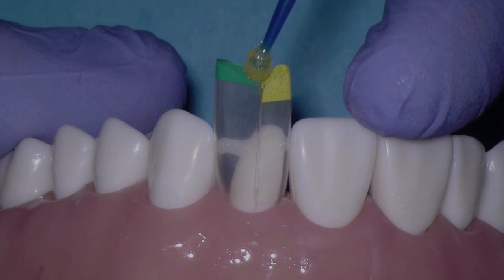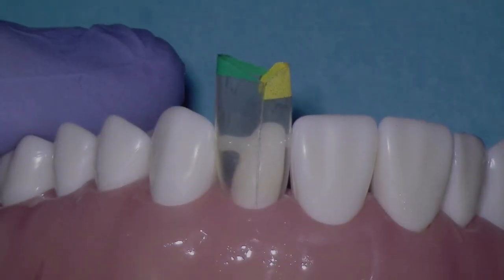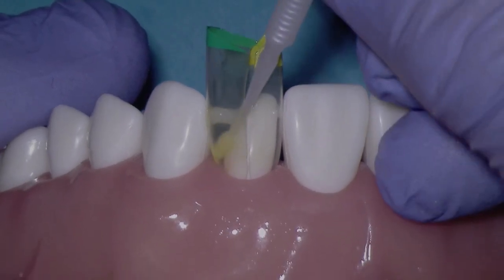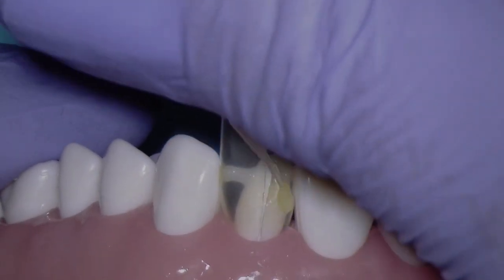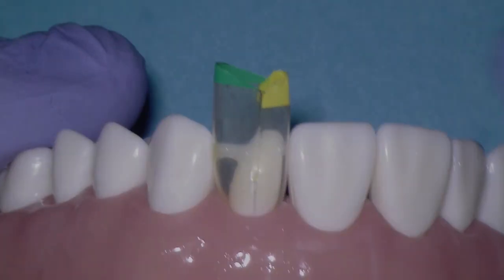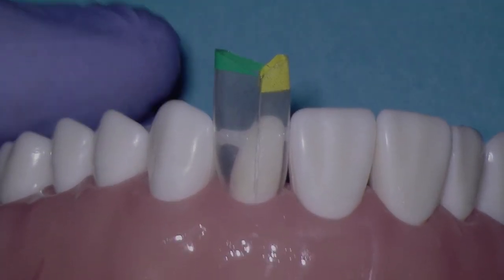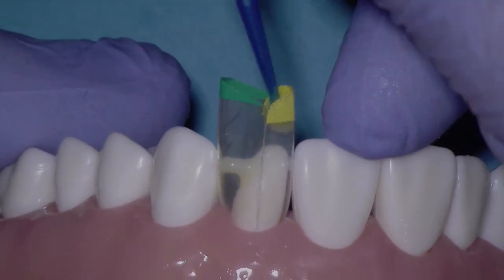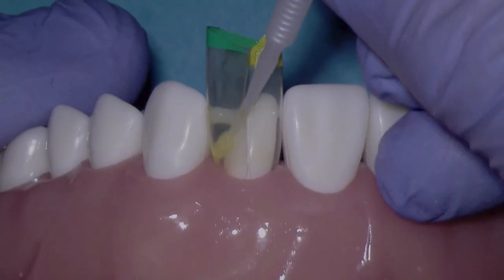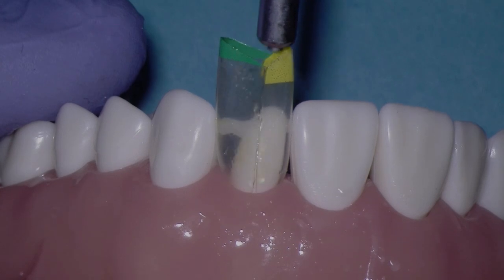Now let's go ahead and bring in a large application of Scotchbond Universal Plus. We're going to come in with the adhesive and we'll bathe the area with a generous amount of adhesive. You can also use the large applicator for this. Then always make sure that the matrices are seated. We want to use a generous amount of adhesive everywhere. This is something that you just have to get used to. So using a small applicator does a good job of getting the adhesive here in this very small area under the contact area. Okay, let's go ahead and air thin, but do not light cure.